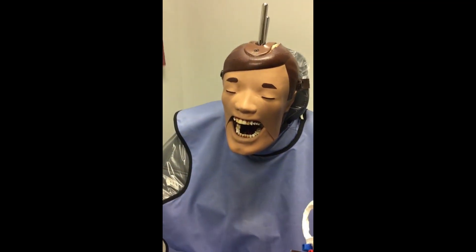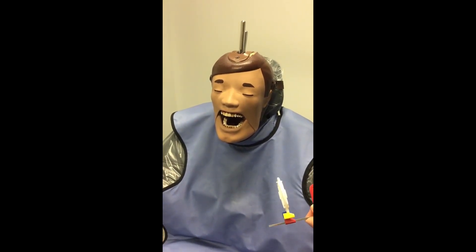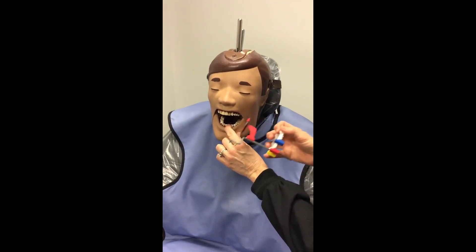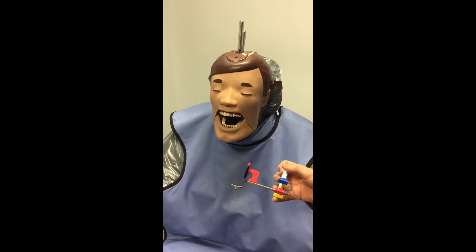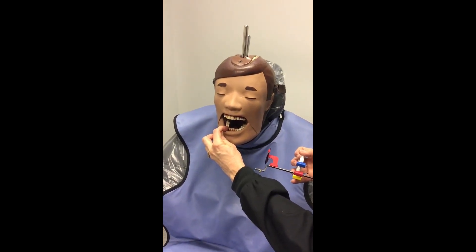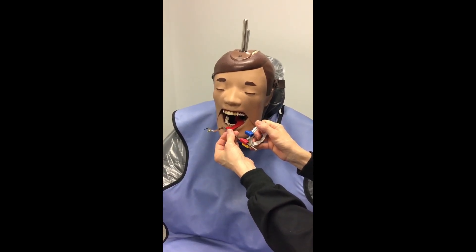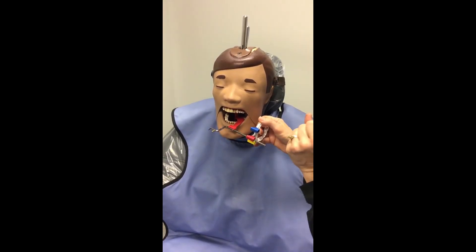When using a corded sensor, there is one thing that's a bit different with placement. We've talked about bringing the front of your sensor up between the mandibular centrals when using your PSP plate. When using the Dexis corded sensor, they're a little bit smaller, so you have to angle it over to the canine on the opposite side in order to get your canine on this side. It would be angled further in the floor of the mouth compared to the PSP, which is pulled up right between the two front teeth.